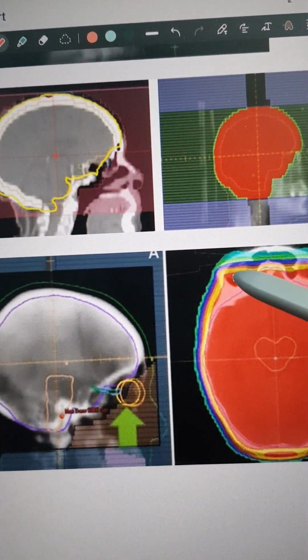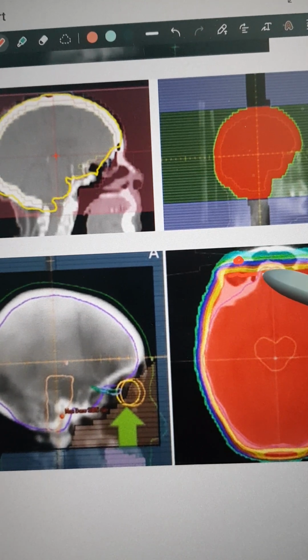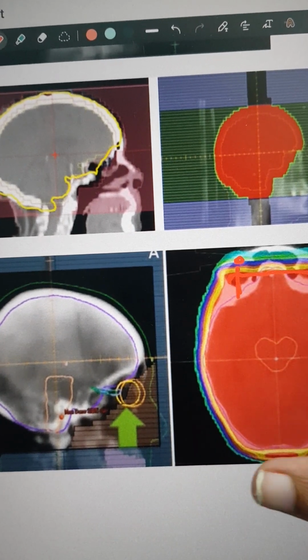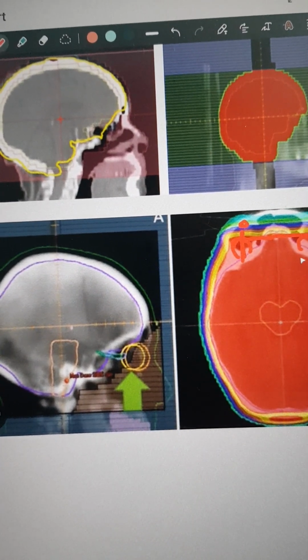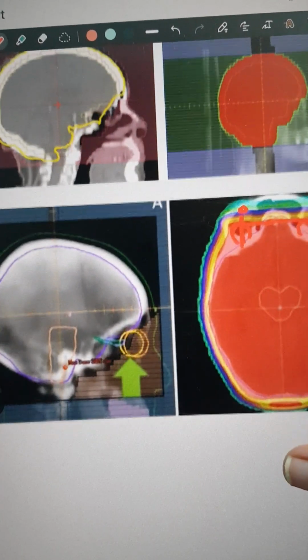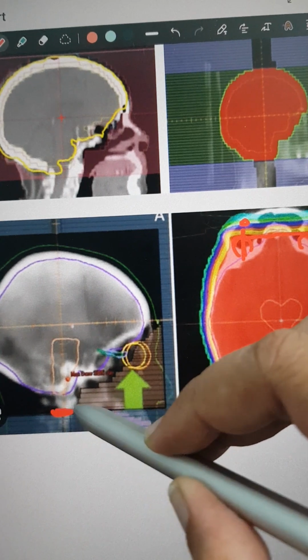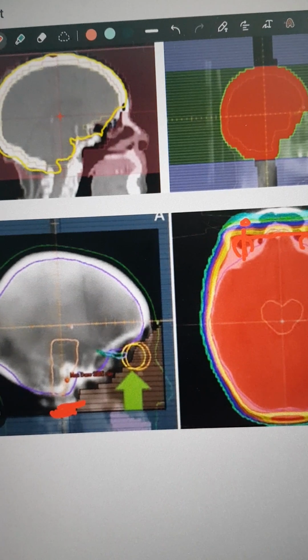Yeah, so posterior, if this is our lens, 2 centimeters posteriorly you will include the posterior globes of the eyes as well, because we are trying to cover the optic nerves, because meninges will cover over there, right? So CSF circulates around the optic nerve. And therefore we will also include the orbital apex for the German helmet technique, and you will go until the C1 and C2 vertebrae lower border because there is high risk of recurrences over there.